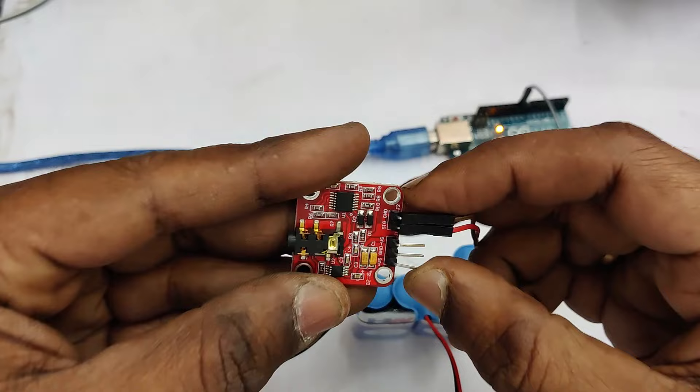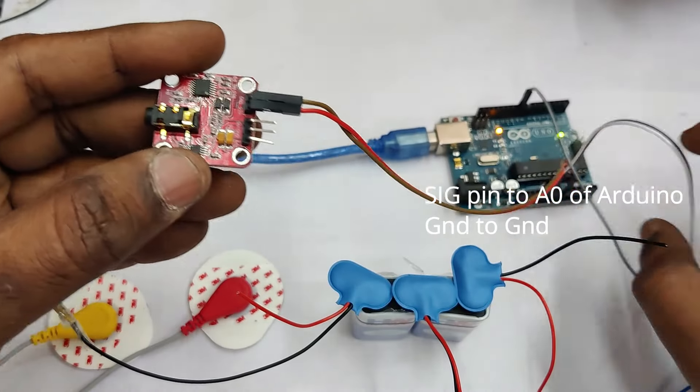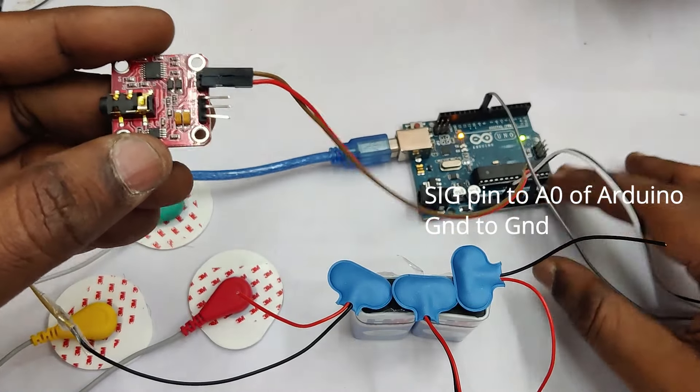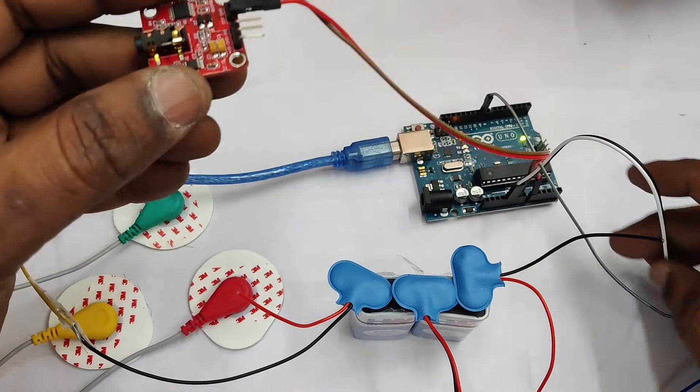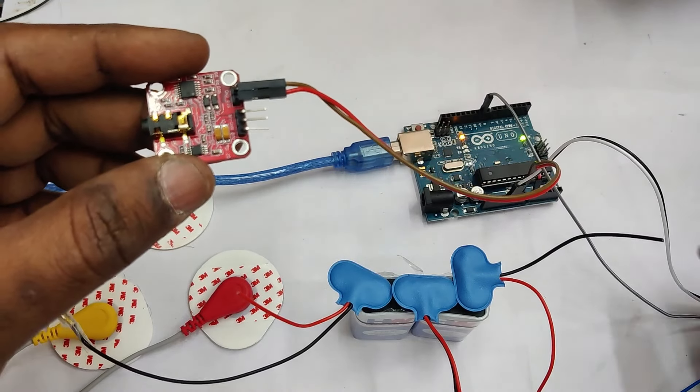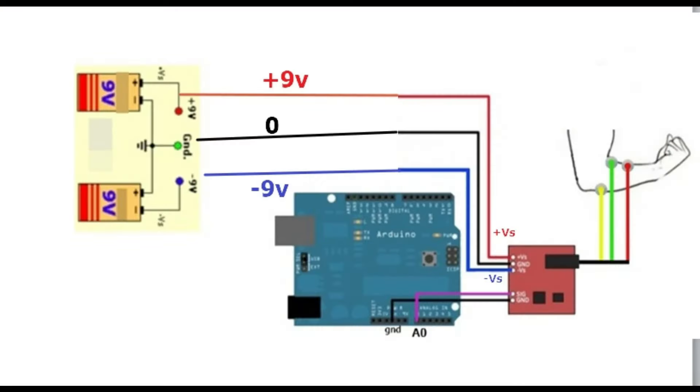The signal pin of the EMG module goes to A0, that is analog zero pin of Arduino and ground to ground. These are the two pins on the top of the EMG module. Now we have to connect the dual power source that we have created. Now we have generated the power source plus nine volt, zero and minus nine volt using two nine volt batteries.